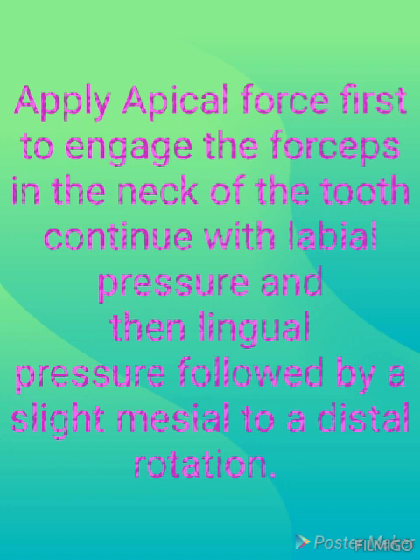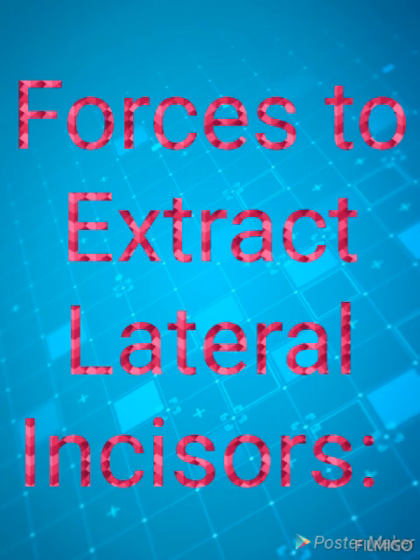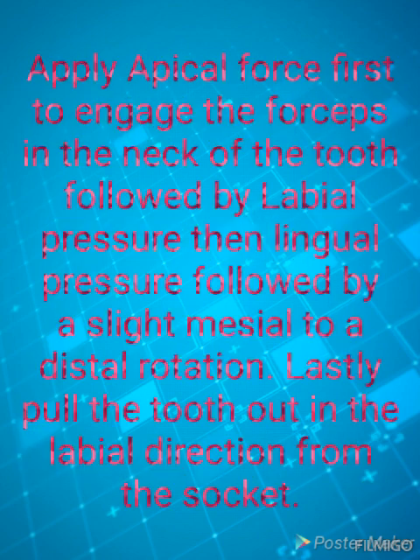I already told you that for maxillary anteriors we have to give the rotational force. Here mandibular anteriors also follow this rule. So lastly give a pulling motion towards the labial direction to extract the tooth. Next we are going to see forces to extract mandibular lateral incisors. Apply apical force first to engage the forceps in the neck of the tooth, followed by labial pressure, then lingual pressure, followed by a slight mesial to distal rotation. Lastly, pull the tooth out in the labial direction from the socket.